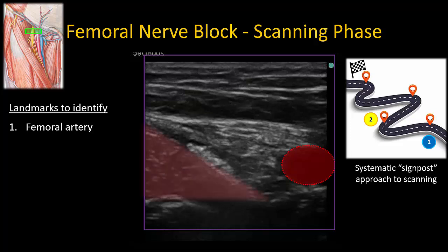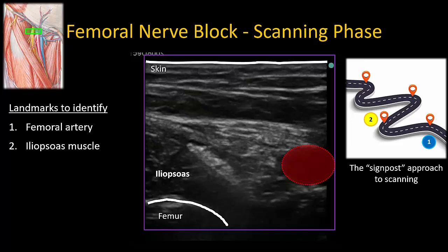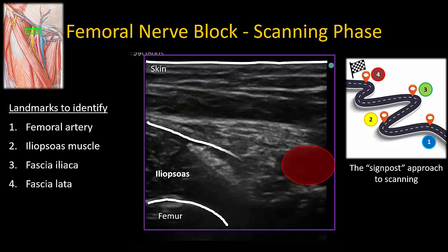The second signpost to identify is the iliopsoas muscle, a dark hypoechoic triangle lateral to the artery. The femur may sometimes be visible deep to it. There are two fascial layers overlying the iliopsoas muscle — the fascia iliaca and fascia latae, which are the third and fourth landmarks to identify. By definition, the fascia iliaca is the layer investing the iliopsoas muscle, and the most important thing to know is that it runs medially to dive under or deep to the femoral artery.